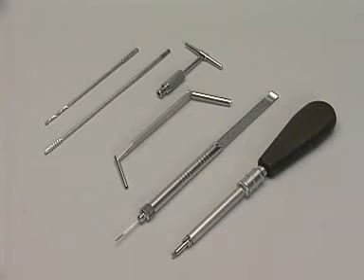For fixation of the tibia, the following instruments from the large fragment set are needed. The 3.2 mm drill bit, the 6.5 mm tap for cancellous bone screws with T-handle for quick coupling, the appropriate drill sleeve, the depth gauge, and the hexagonal screwdriver.